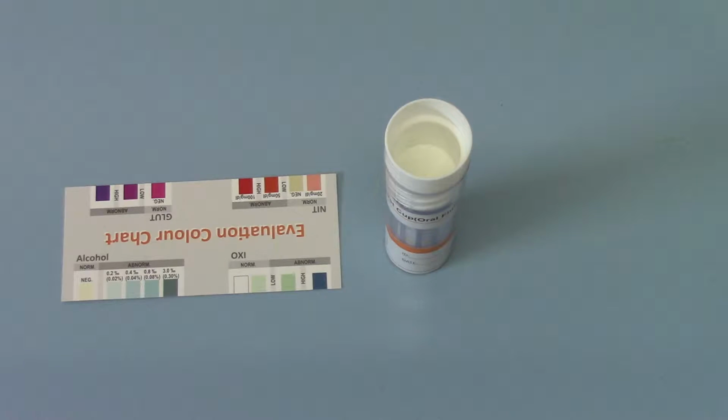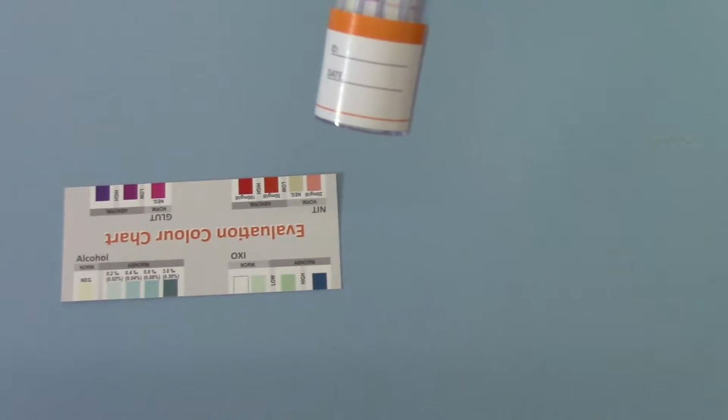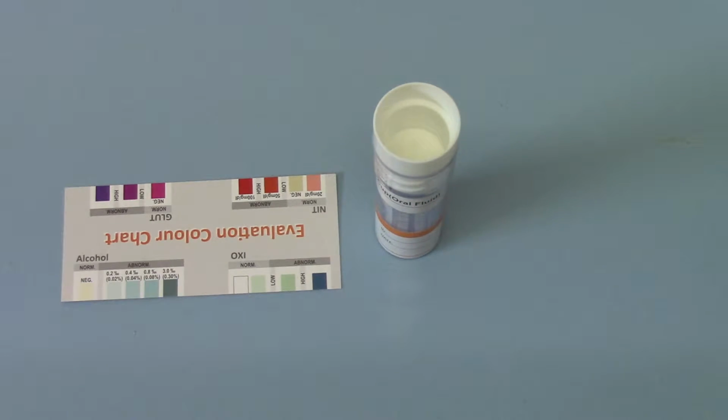screening. There is space on these barrels for you to label, identify the donor and the date. So if you are running a sequence of 10 or 15 tests, you can run a procedure where you are sampling from an individual, asking them to leave the room, sampling from the following individual, and then transferring them back for the results.